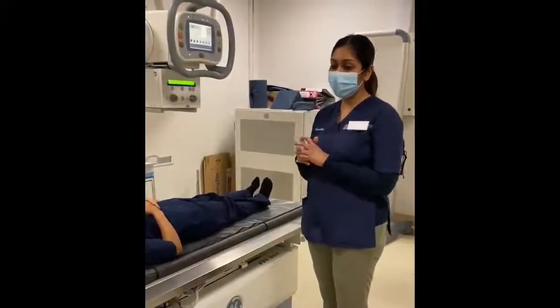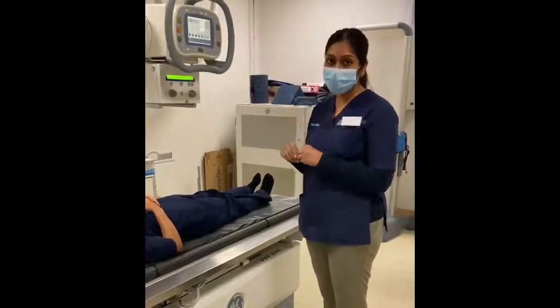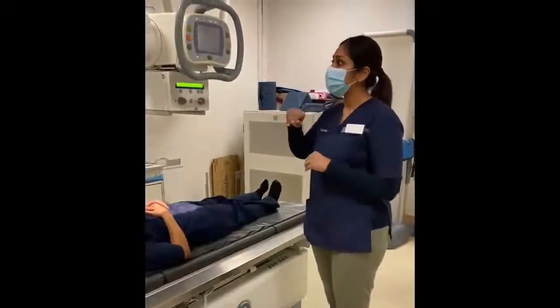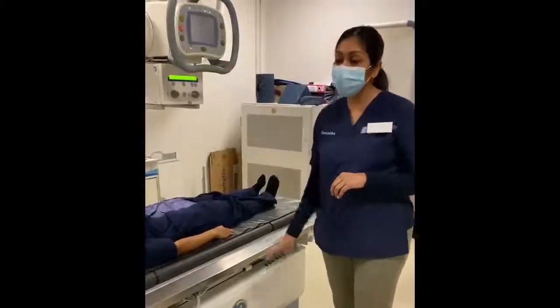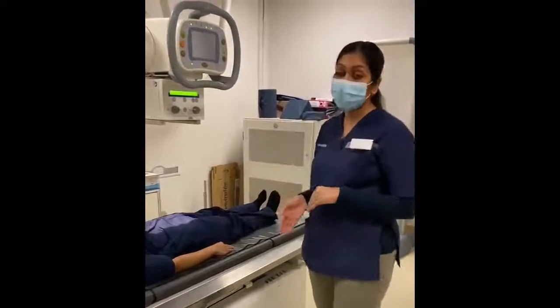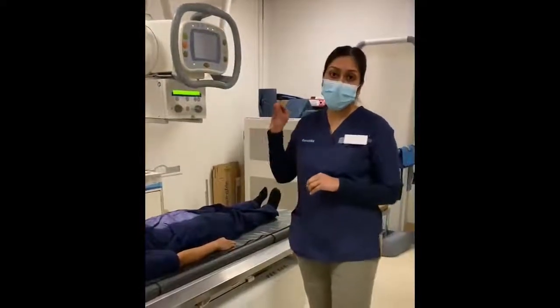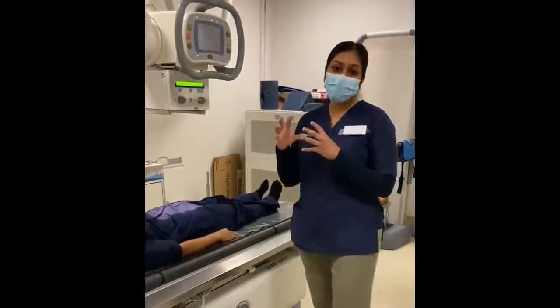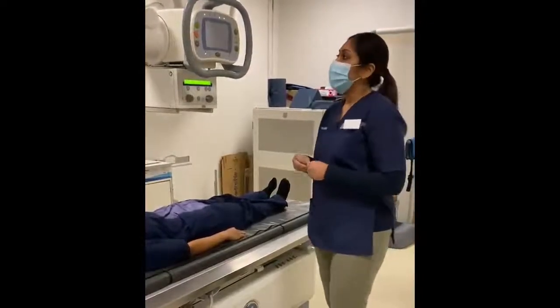Basically, before our patient comes into the room, you need to set up your tube and your image receptor. Most importantly, make sure that your X-ray tube is aligned to your image receptor. It should be perpendicular to each other. The FFD that we're using is 100 centimeters, just to ensure that you have nice detail of your thoracic spine.